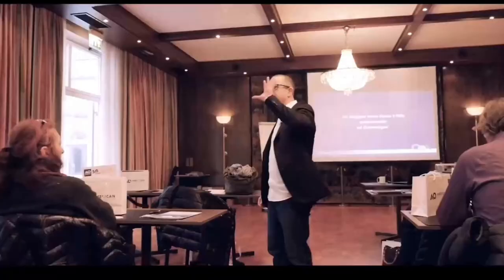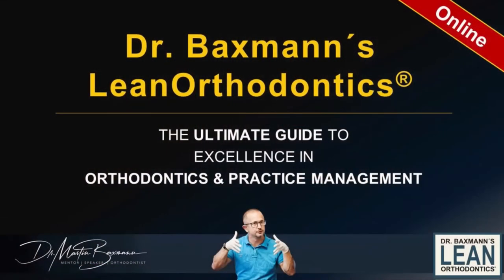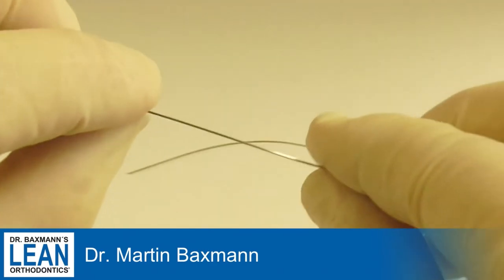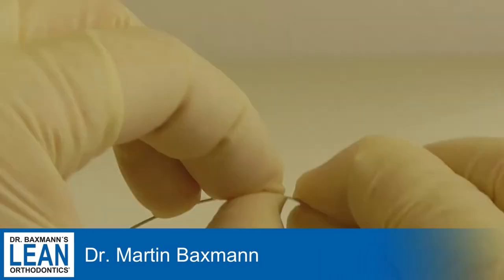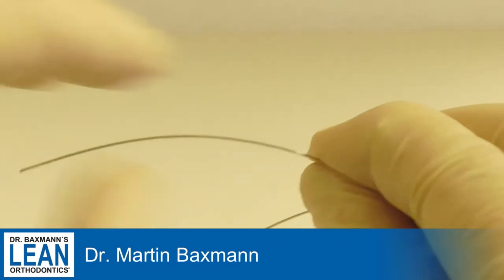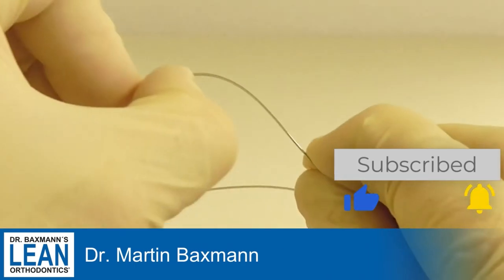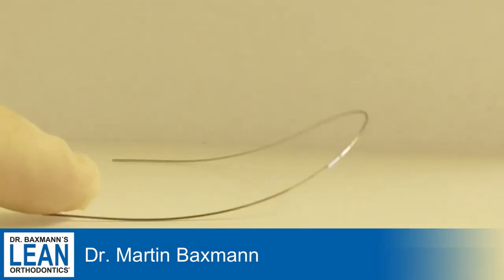Now let's get down to it. The sweep wire is the most common wire we use in my practice to correct a curve of Spee. What you use for that is a 17×25 stainless steel wire or an 018 stainless steel wire, and simply your index finger and your thumb — which I call the Baxmann pliers, already a part of your hand. You hold with one hand, then stroke it smoothly and carefully, and you have a very nice curve of Spee bent into the stainless steel wire.